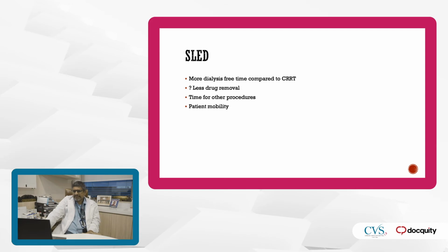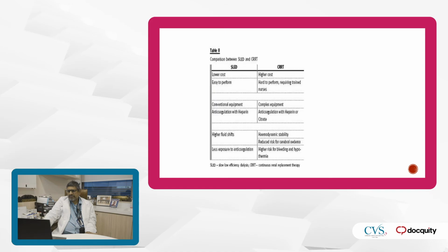Okay, so this slide says the same thing. Basically, SLED compared to CRRT is cheaper to do, easier to perform, uses conventional equipment, and generally can be used just like CRRT in those with low blood pressures. Okay, this slide basically summarizes what I've already mentioned.